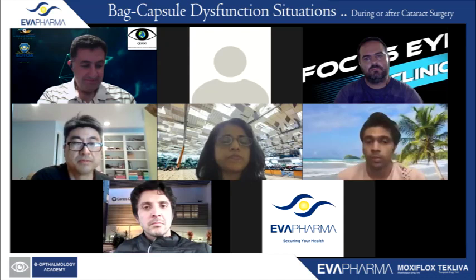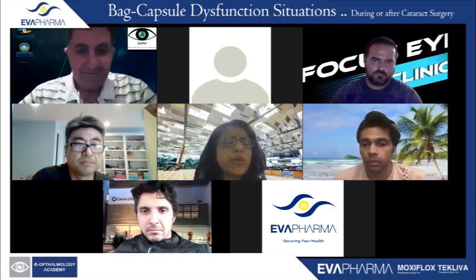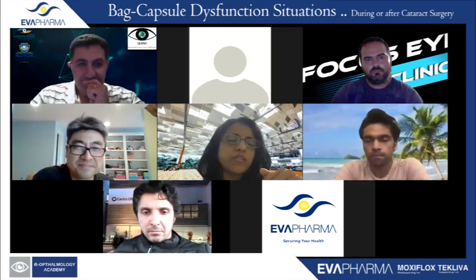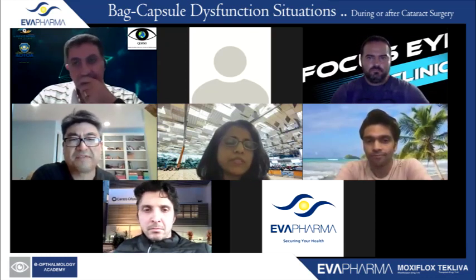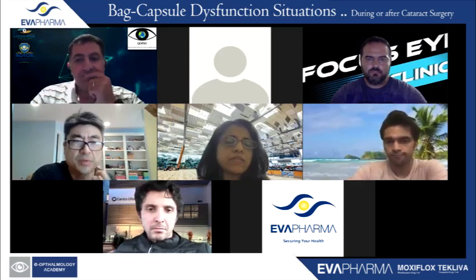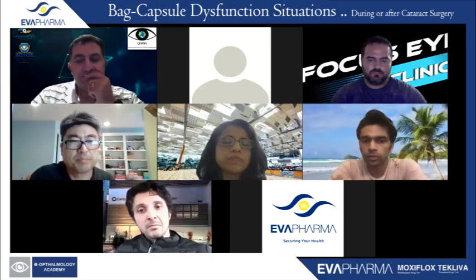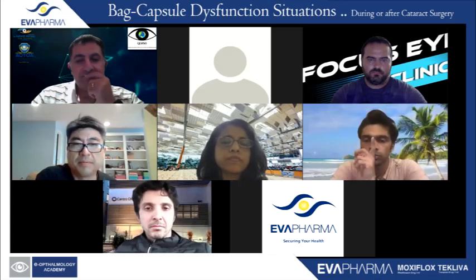That's it. Okay. And I guess it would be kind of playing around a bit too much, if you try to make it shorter and then you find that you've gone too much on one side and too less on the other side. So yeah, it's not that finicky though. I mean, yeah, you could, but your point is well taken. But once you do it enough, it's pretty intuitive. You won't feel like you have to keep cauterizing it to get a big enough bulb there.